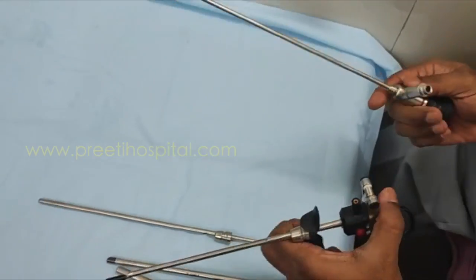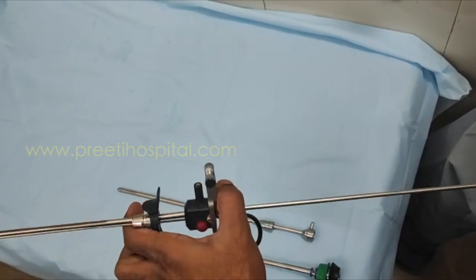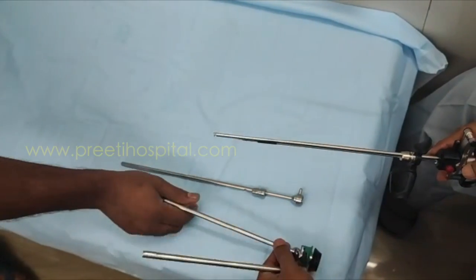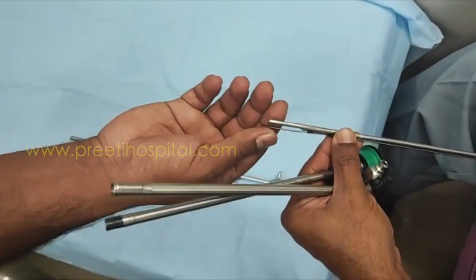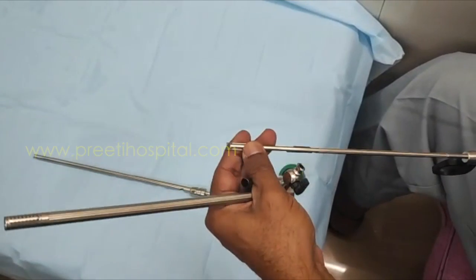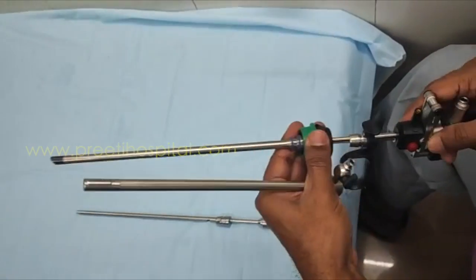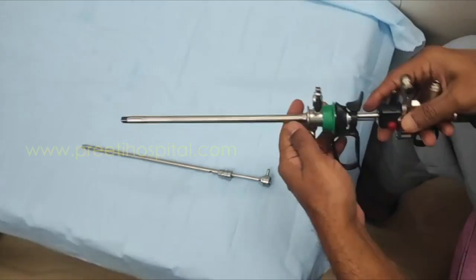This telescope is a normal telescope because it is 22 French — a normal telescope will go. That means it is 4 mm only. Once it is fit it will go, and the entire working element will go into this. You rotate a little bit, and then everything will go into the 22 French.